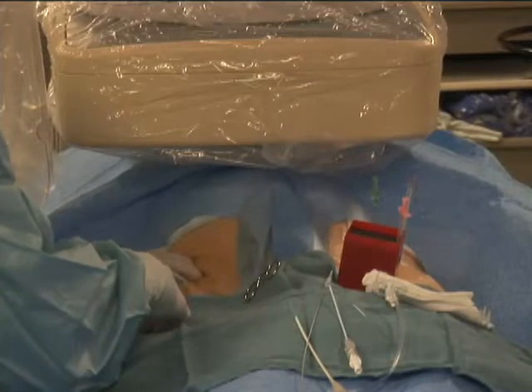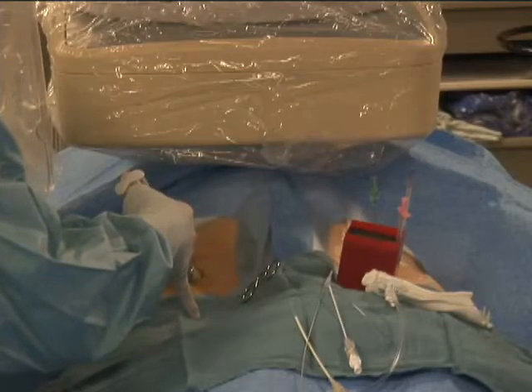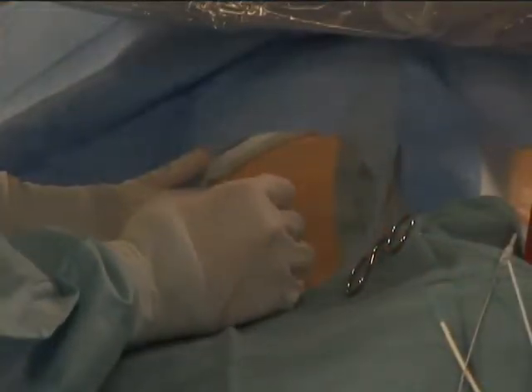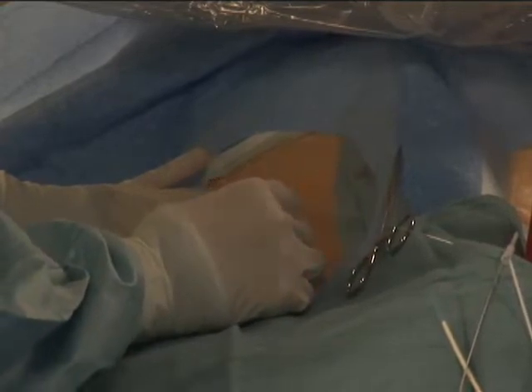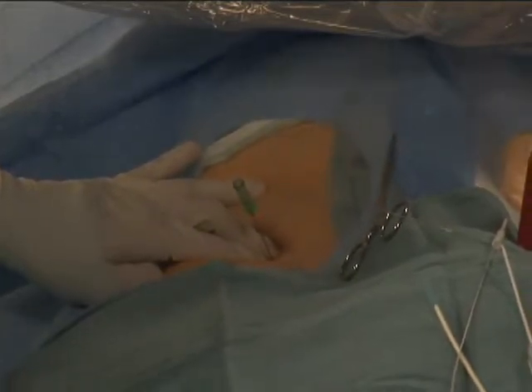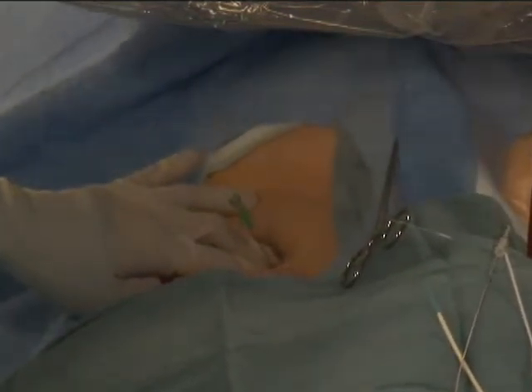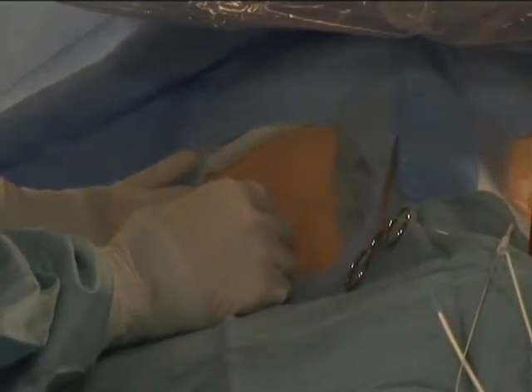The artery is palpated with the left fingers, and the artery is stabilized between the fingers. The micropuncture needle is advanced at the predetermined skin puncture site until the artery is entered and arterial blood is visualized within the needle hub. The needle is stabilized, and the microwire is advanced through the needle and into the vessel where it is visualized under fluoroscopy to advance into the distal aorta, thereby verifying that the wire is not entering any accessory vessels branching off of the femoral or iliac arteries.